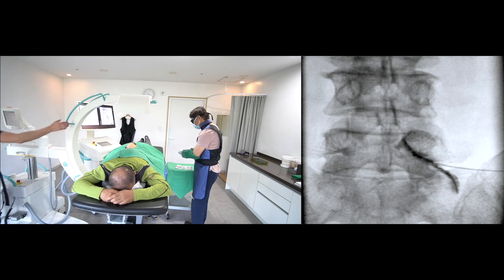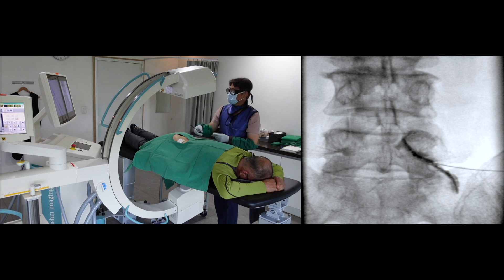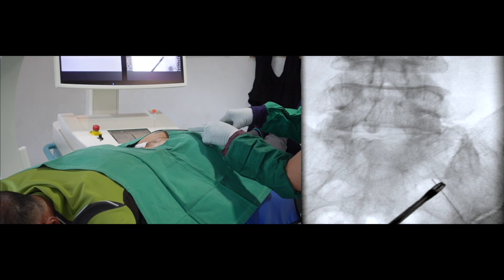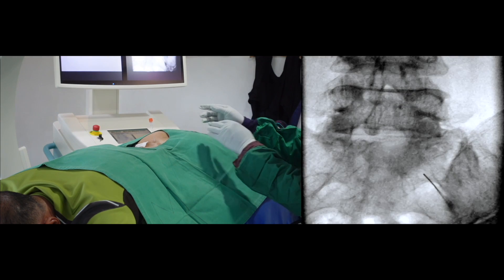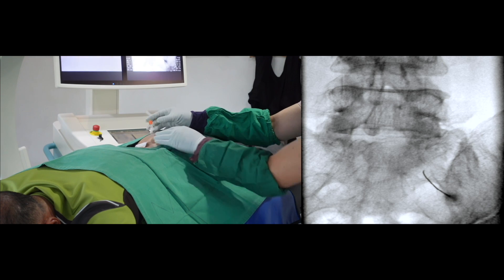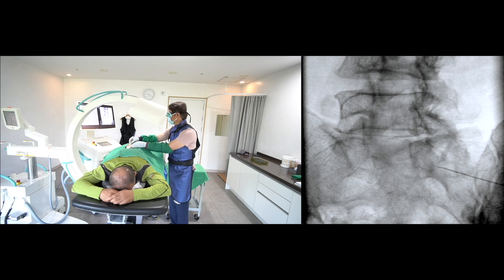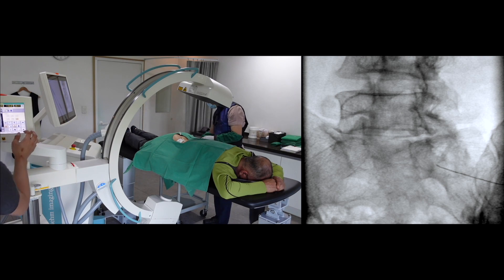The next target is the right S1 posterior foramenal space. The S1 nerve root is supposed to be compressed by subarticular stenosis at the L5-S1 disc level. The proper identification of the posterior hole of S1 is a crucial point of successful needle placement. The posterior hole margin is fainter than the anterior hole and is located in the upper medial aspect. Identifying the needle penetration depth is also a crucial factor. Use your imagination and draw an imaginary line.